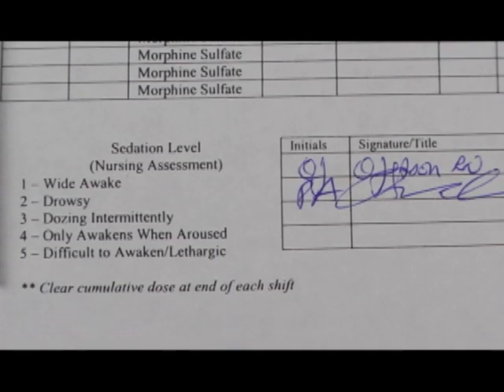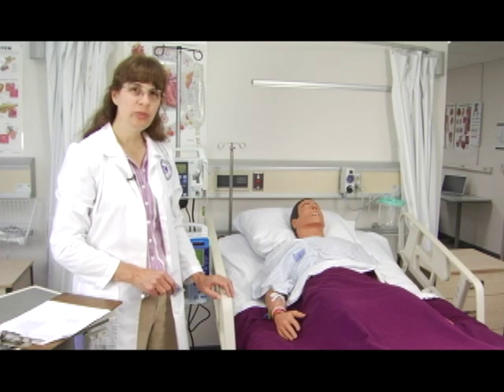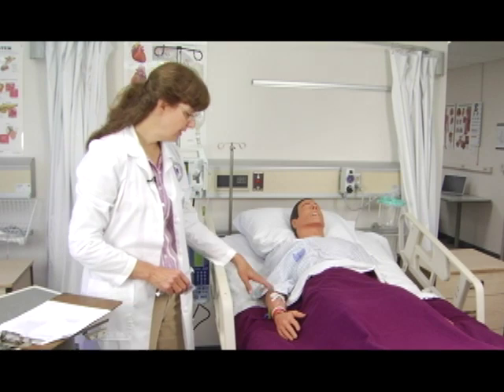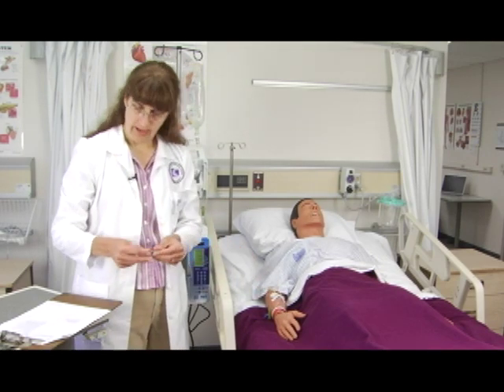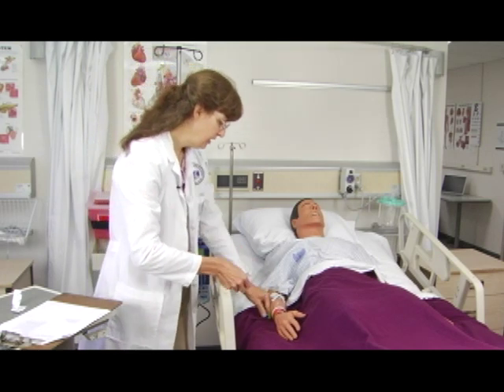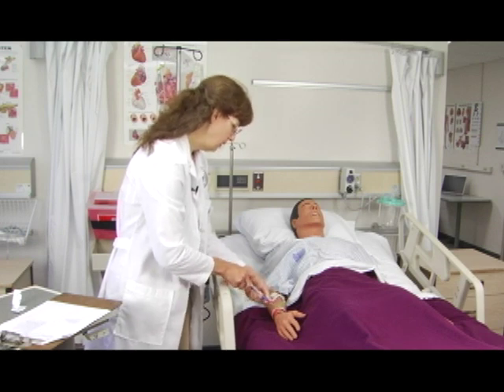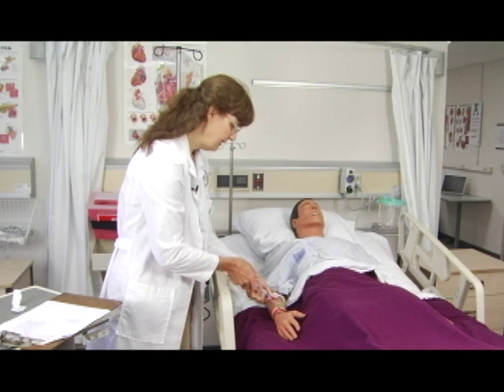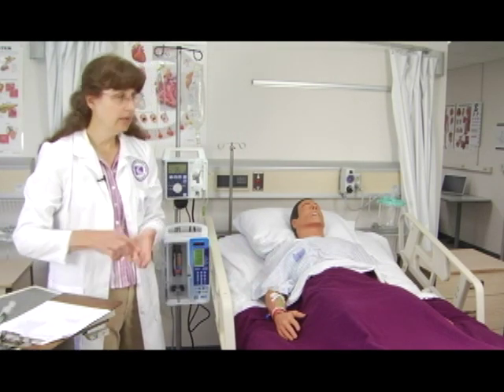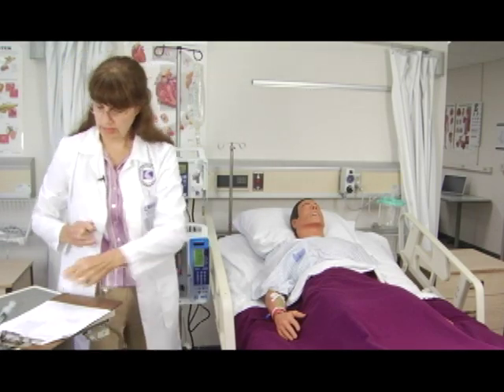Now I'm going to show you the PCA pump portion of this. Now you're ready to connect the PCA tubing to your patient's IV site. The first thing you're going to want to do is to assess the IV site and make sure that it's patent. You'll bring in your normal saline flush and go ahead and flush it. And the site is patent.